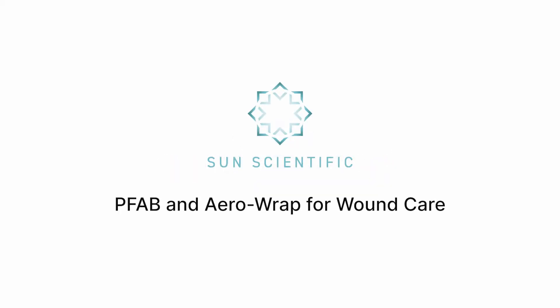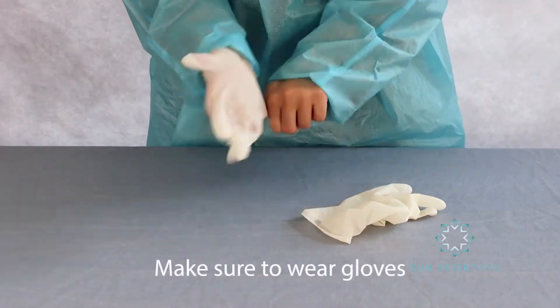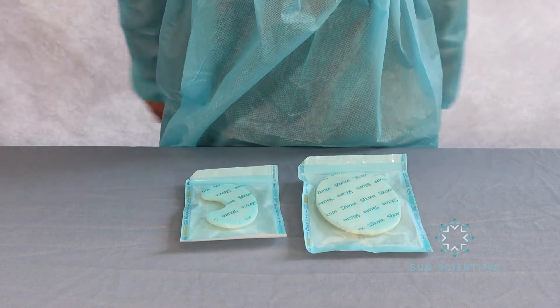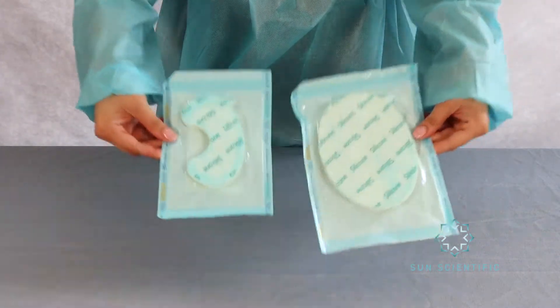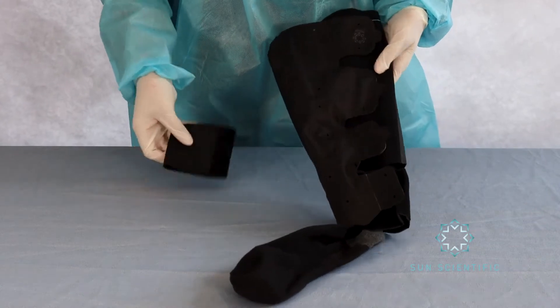Here is how to use PFAB and AeroWrap for wound care. In order to start, you must have a PFAB dressing, which comes in various shapes and sizes, an AeroWrap sleeve with an understock or liner of your choice, and an AeroGauge hand pump.